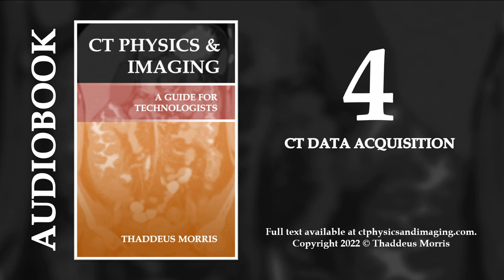Figure 4.1. CT scanners create 3 dimensions of anatomical data. The x, y, and z axes all influence the final image. The x-axis defines the data from right to left. The y-axis defines the data from anterior to posterior. And the z-axis defines the data from superior to inferior. Why do these axes matter?